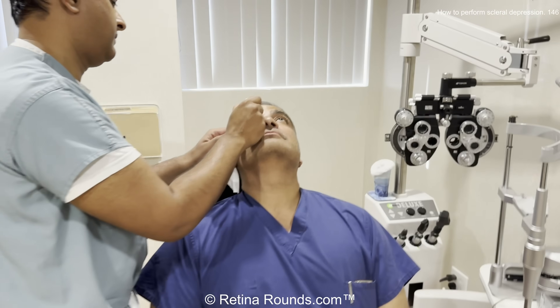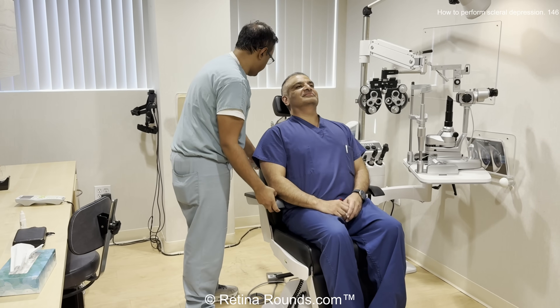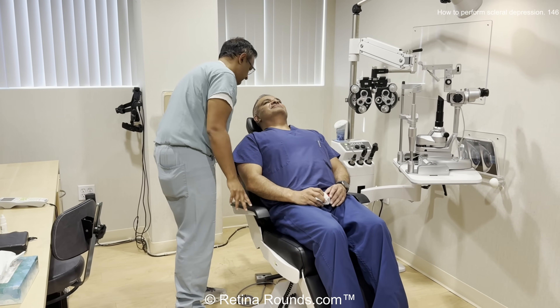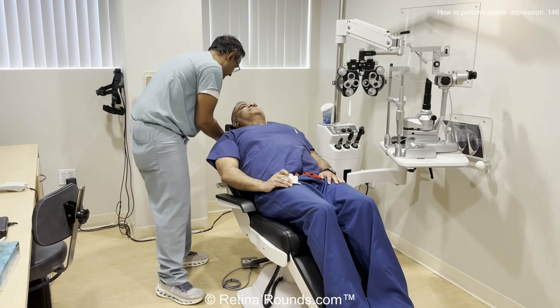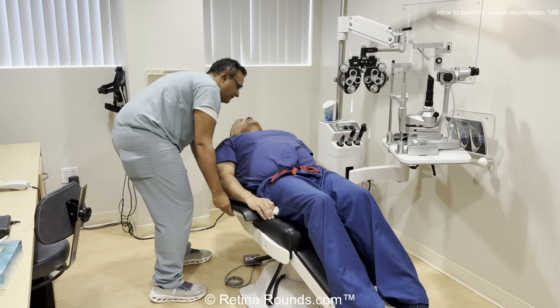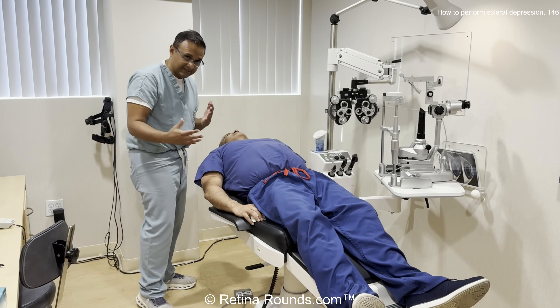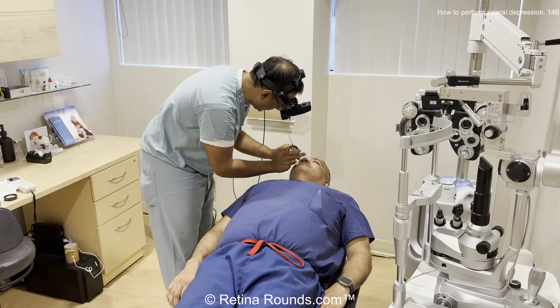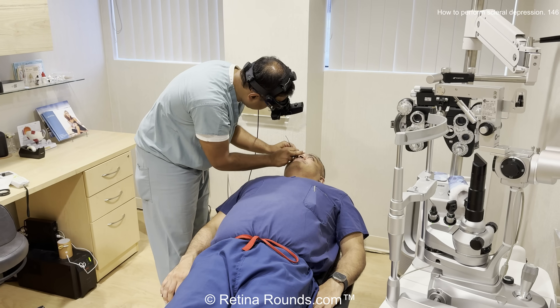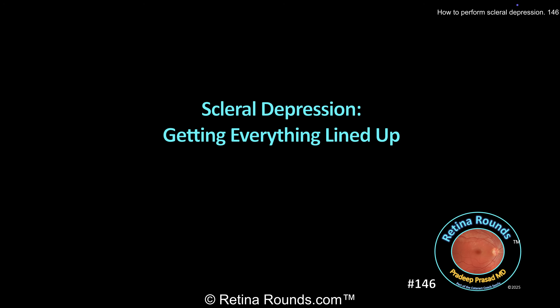Okay, let's show you an example. We're going to start by applying some topical proparacaine to both eyes, and then recline the patient back slowly, telling them what we're going to be doing at each step of the way. We're going to adjust the headrest and confirm with the patient that they feel comfortable. We want them so that their head is pointed straight up to the ceiling. We do want to raise the chair height to a comfortable height so that we're not hunched over the patient. Here's an example of the chair being too low — you can see I'm hunched over the patient, and over time that's going to cause injury to my back.